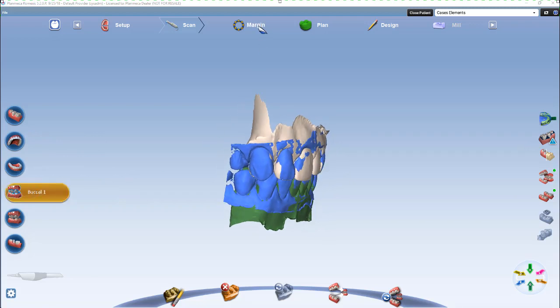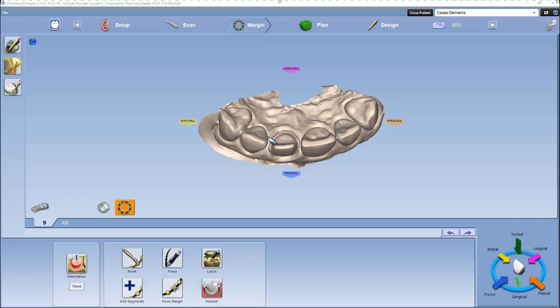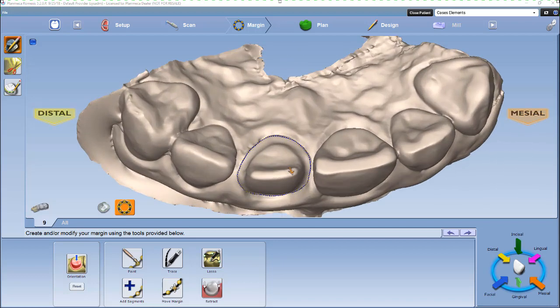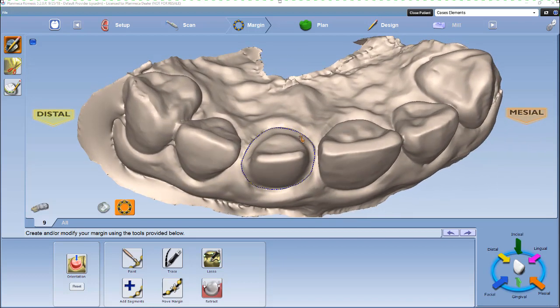Now we're going to move to the margin tab. In the margin tab, you'll do your orientation first, which typically pops up first, and then you'll mark your margin. You'll notice here I already have my margin marked.